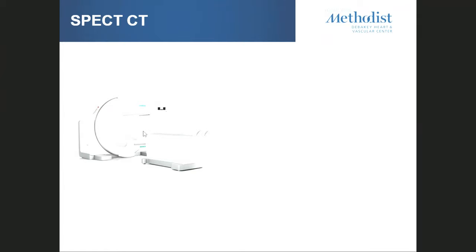So what type of detectors do we use? I know Dr. Mamarian covered that before. I know you're eating, but I don't want to put you to sleep, so I'm going to keep asking questions. CZT or sodium iodide? Sodium iodide is the detector that we are using here, and we capture the photons that come from the different radiopharmaceuticals we use with SPECT.